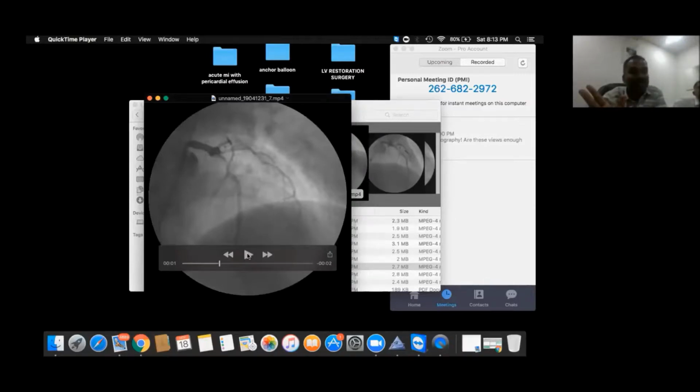So what's the reason? A catheter tip spasm is the most important thing you have to rule out in such cases. There are plenty of case reports in JACC which you can see. Ostial LMCA is a very tricky thing. Sometimes you can't make out a lesion. Sometimes you can see a lesion, but it may not be there once your catheter is out.